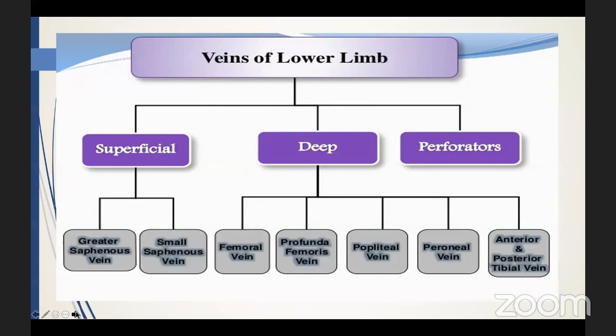The other point here is below the knee, each artery is accompanied by two veins. So anterior and posterior, we would be able to see in longitudinal, if you scan your patient's below knee vessels, you would see an artery line in the middle between the veins, either anterior or posterior veins. So this is the normal appearance of the veins below the knee.